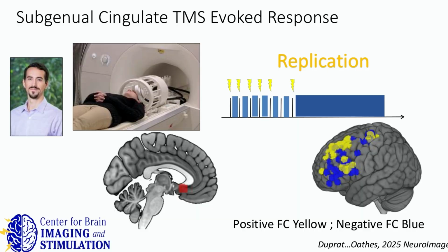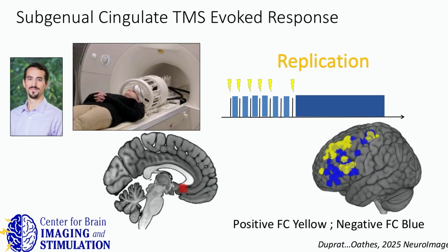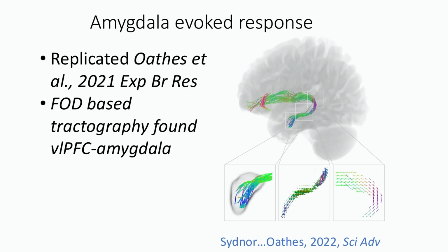So we played around with resting connectivity guided stimulation. We do our ping in the scanner with TMS fMRI, and we said, hey, everybody's chasing this anti-correlated target. What does it mean if you took a positively correlated target and you ping that? Let's see what the evoked response in the subgenual looks like. And that's something that we're actually continuing with a bigger clinical trial.